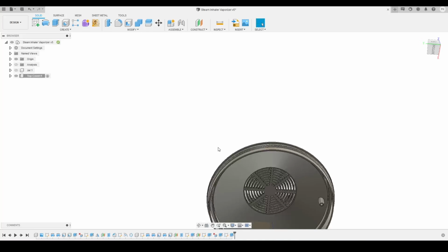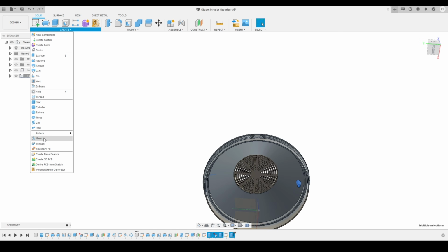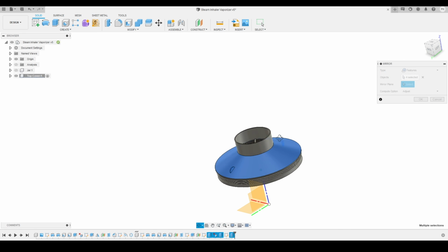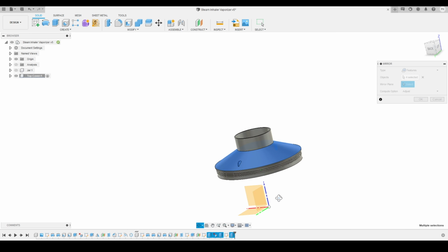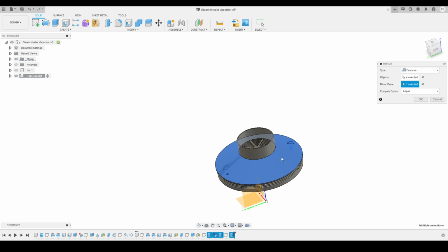Now I will select these four features, 1, 2, 3 and 4, and we'll go on to the create panel over here. We'll activate the mirror tool and select the mirror plane, and I'm going to use this plane as a mirror plane. Here you can see this plane, and now it's all getting mirrored. Here you can see, the top was getting mirrored on the other side.